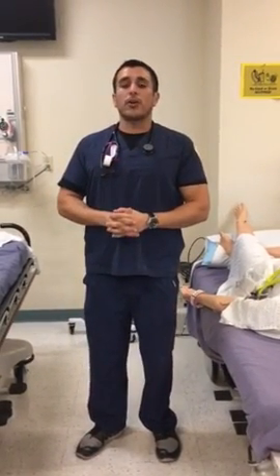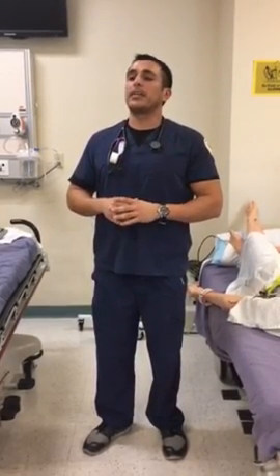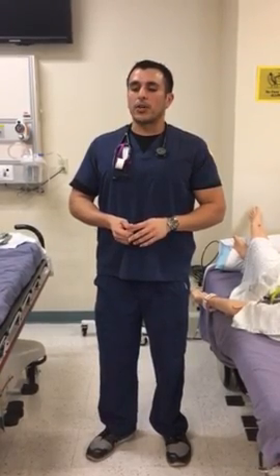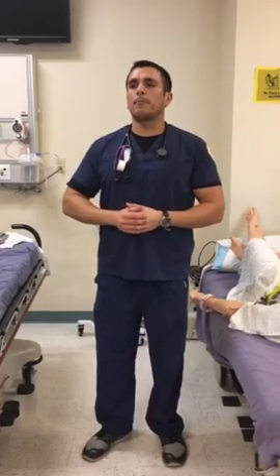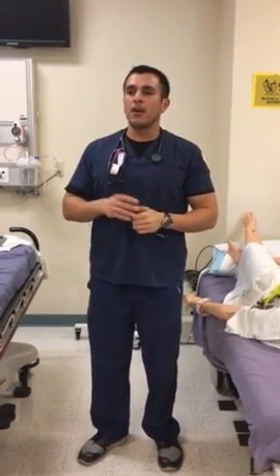Things that I would be charting, again, would be the vitals, so the blood pressure, respiratory rate, heart rate, lung sounds. I would also be documenting how many attempts it took, so that would let anyone know if it's a difficult intubation. I would also be charting tube size and tube placement. For women, normally they're about a size 7.5. For men, they're usually a size 8.